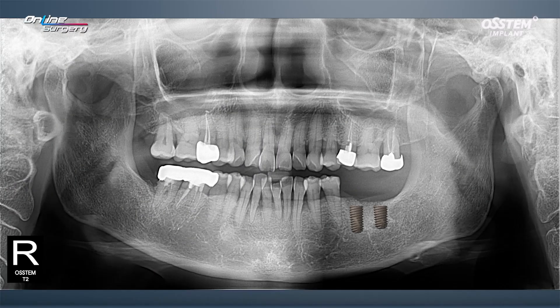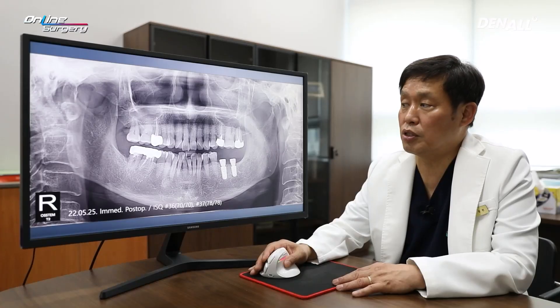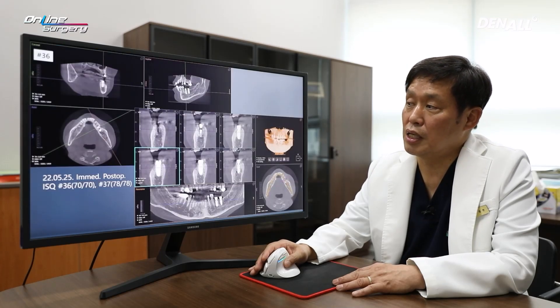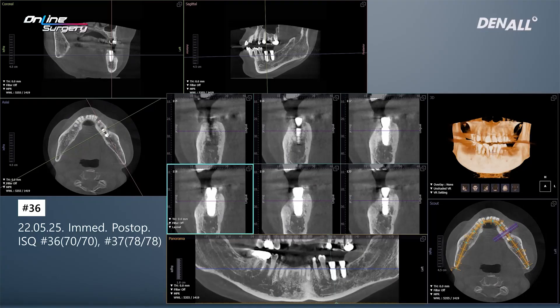This is how the plan was made to place two implants. This is the immediate post-op image. After placement, ISQ value was about 70 in number 36 and about 78 in number 37 — very favorable. Healing abutments were connected and surgery was completed. In the immediate post-op image, in number 36, in the area where AOS was grafted, on the buccal side, it is well maintained.